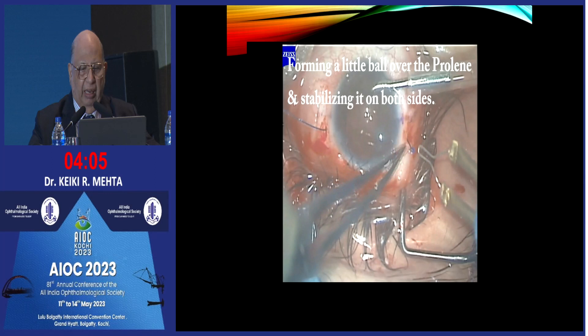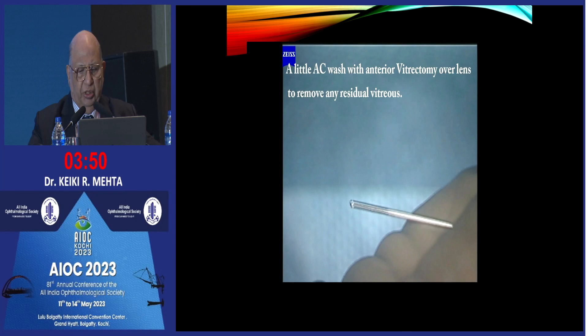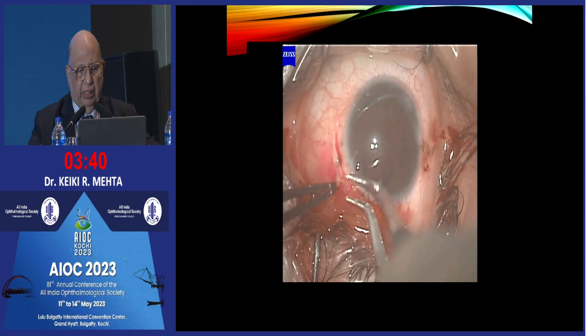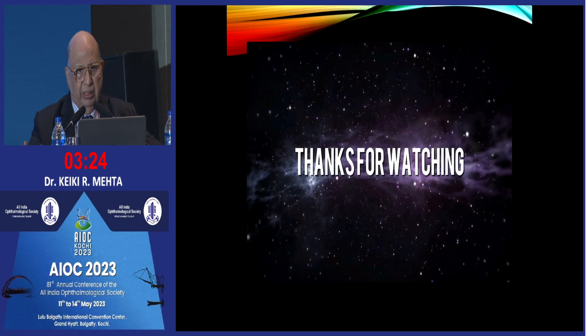You close with a single or double cross-stitch. Now you form a little ball of proline, hold the base tight so both ends are stable, and adjust it in place. At this stage your lens is locked in position. You do a little core vitrectomy on top utilizing an anterior vitrectomy, and you can apply a little steroid. Then use coaptation cautery on both sides to bury the knobs — so your knob is buried, eye is stable. That is a simple way of doing a proline suture.